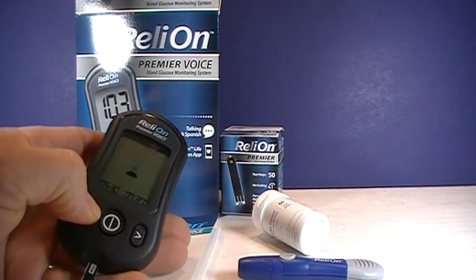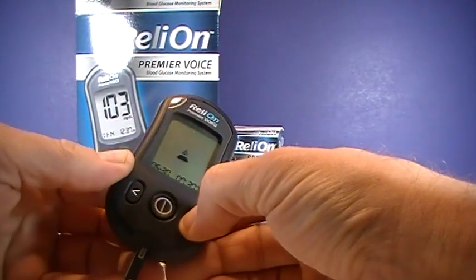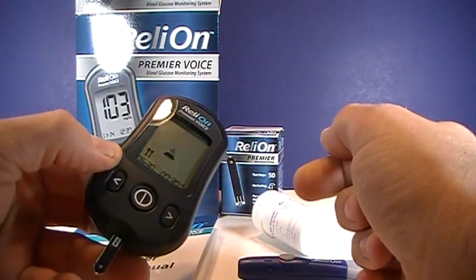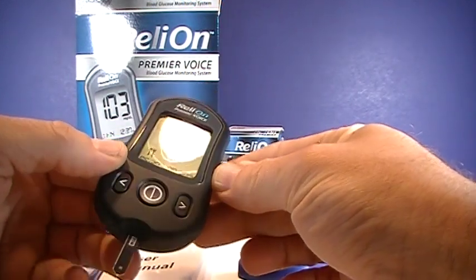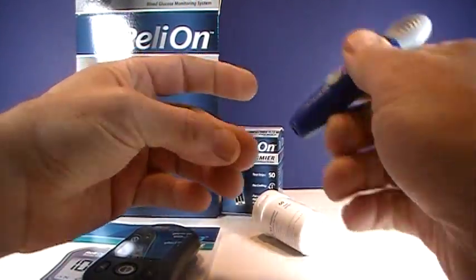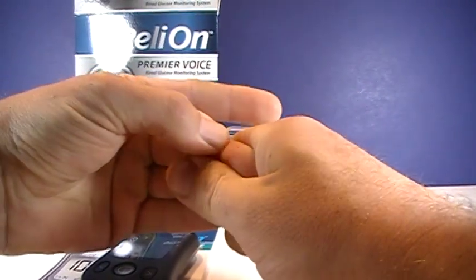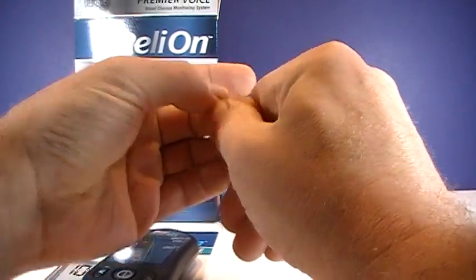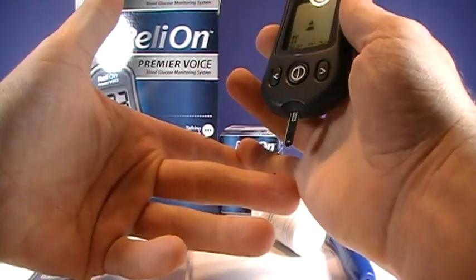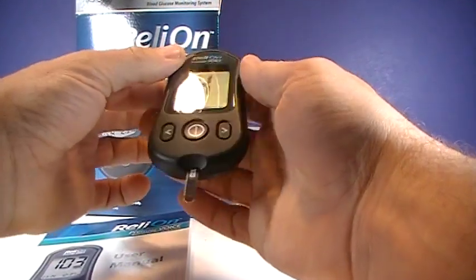You can push it again if you're not doing a control, and we're back to regular. If you hold the right-hand side button, that flags it as a post-meal test. Of course, you wash your hands with warm soap and water, thoroughly dry, and then get your drop of blood. You just press the bottom of the test strip right into the drop of blood, and it beeps once you get enough blood on there.